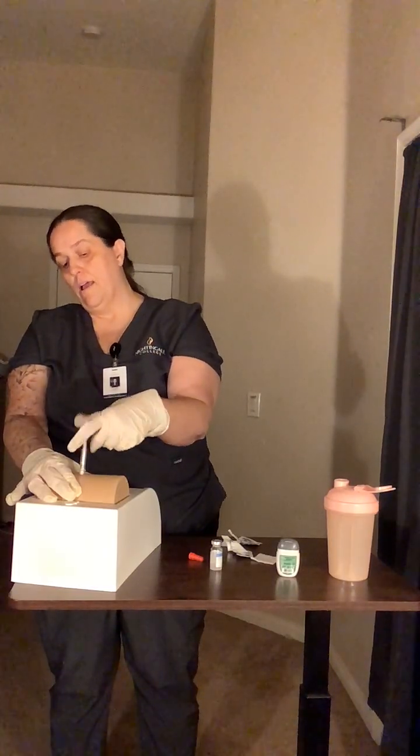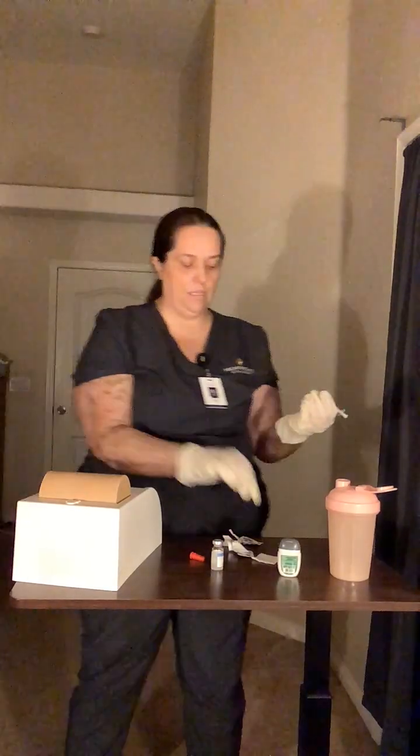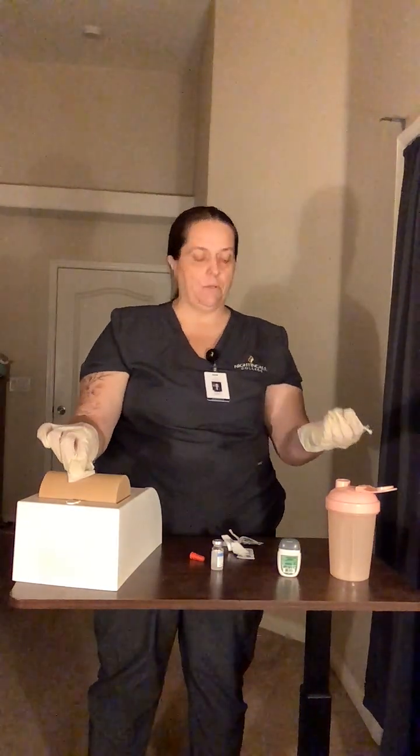Okay, now that it's done, go ahead and take it off, release, get the gauze, put it on the side, dispose of the needle, take off my gloves. Everything's fine on that. Perform hand sanitizer. Thank the patient, put the patient in a comfortable position.